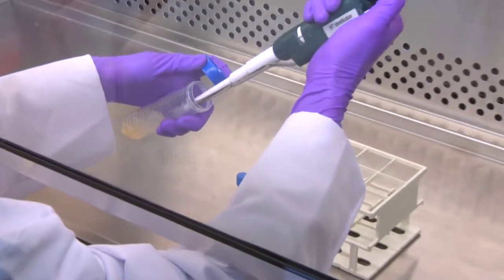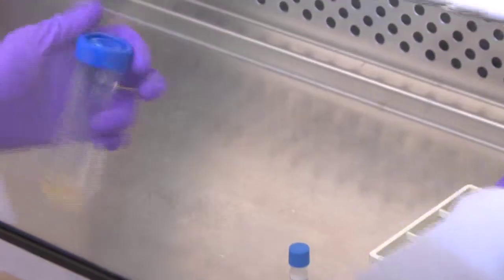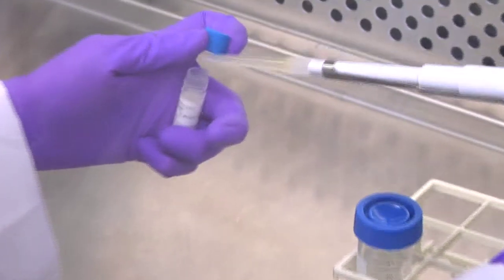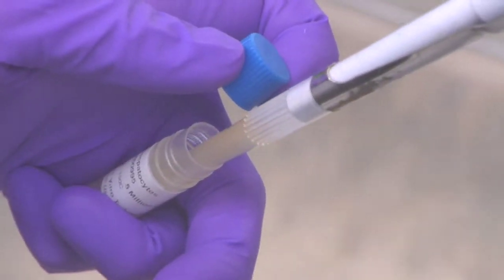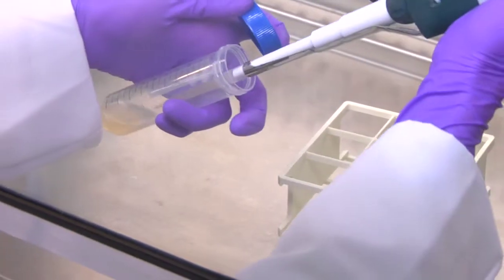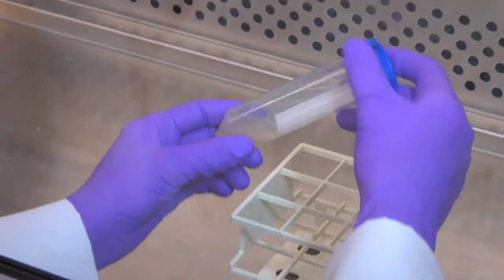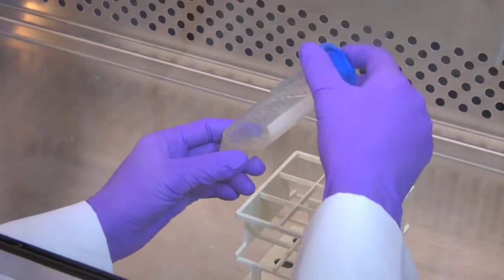Pipette one milliliter of medium from the conical tube to wash the cryovial for excess cells. Pour this back into the conical vial. Cap the vial and gently invert three times to mix the cells evenly.